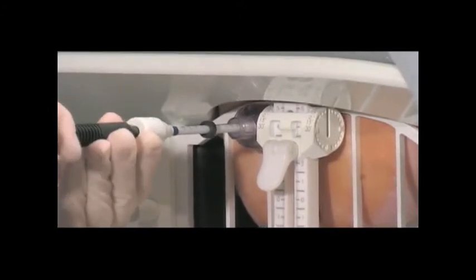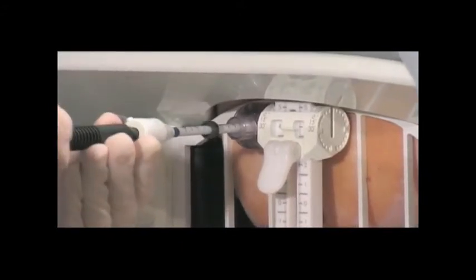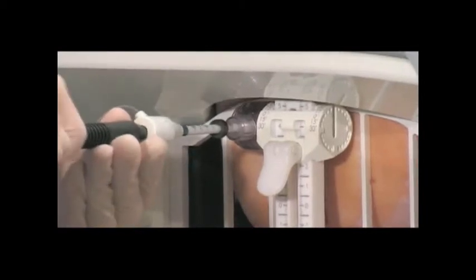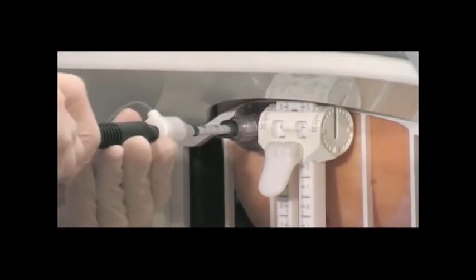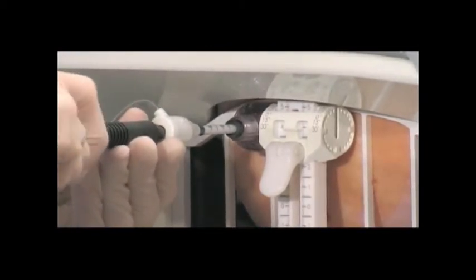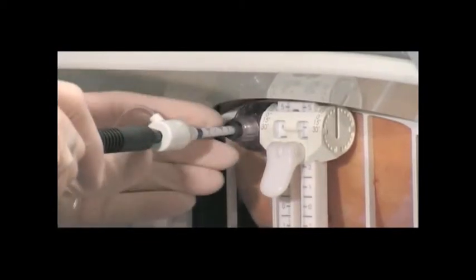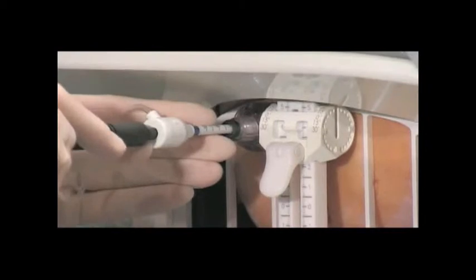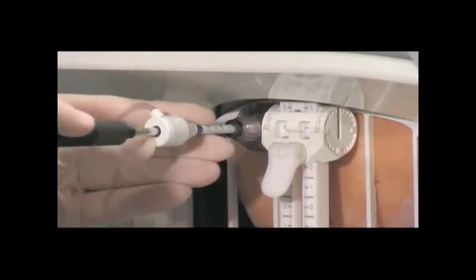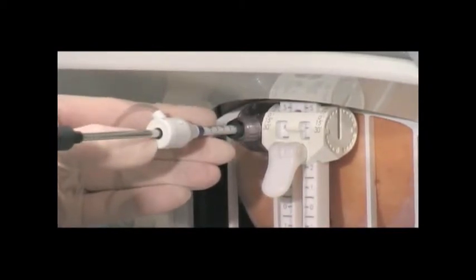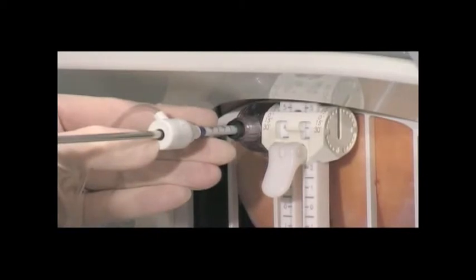Holding the sheath in place, use a continuous clockwise rotating motion to advance the stylet into the breast. This motion will help minimize tenting of the skin. Tighten the hub on the needle guide turret to the calculated depth. While continuing to hold the introducer sheath in place, remove the stylet.